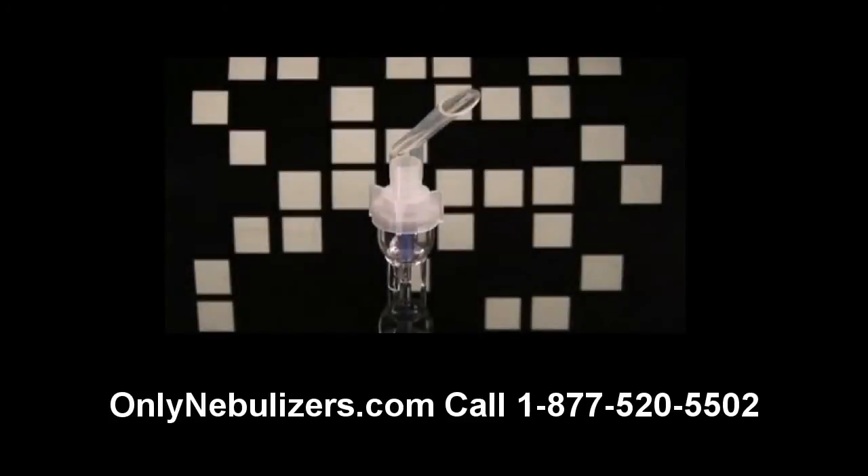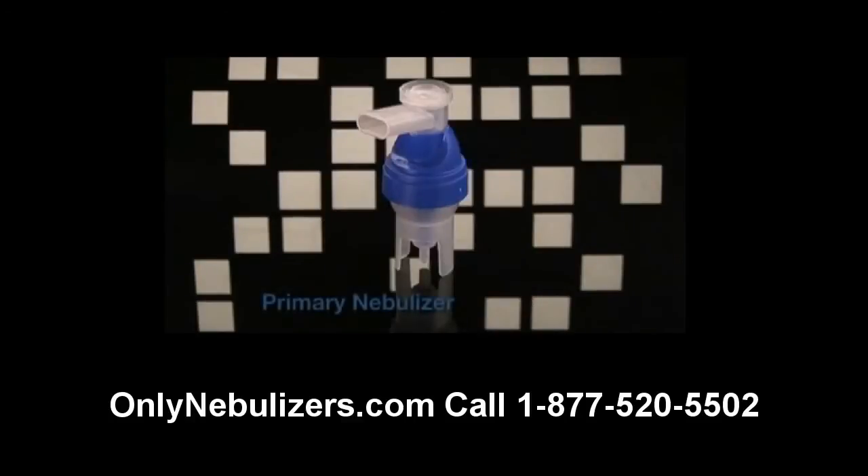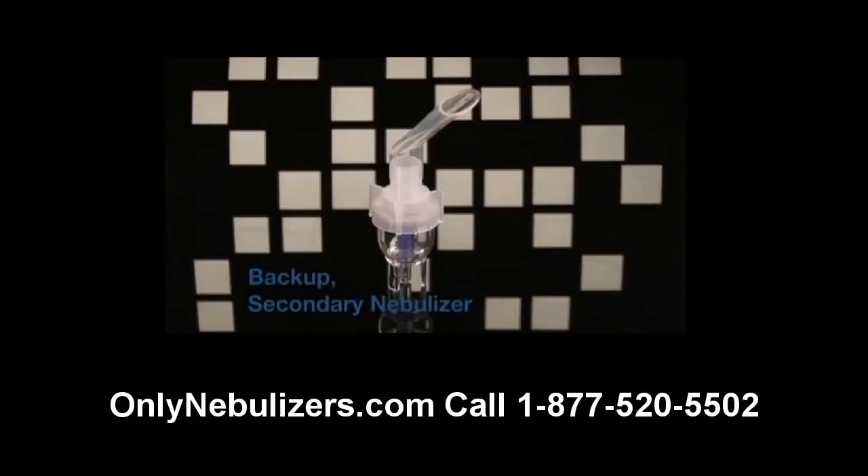You received a disposable nebulizer with your DeVilbiss Traveler Compressor. Please note that you may have also received a reusable nebulizer with your unit. Refer to the nebulizer packaging to determine the type. If you have received a reusable nebulizer, please use that as your primary nebulizer. The disposable nebulizer should be used as your backup should you lose or damage your reusable nebulizer. Please note that in the future you may receive a nebulizer from your provider that looks different, but the care and use of most disposable nebulizers is similar.